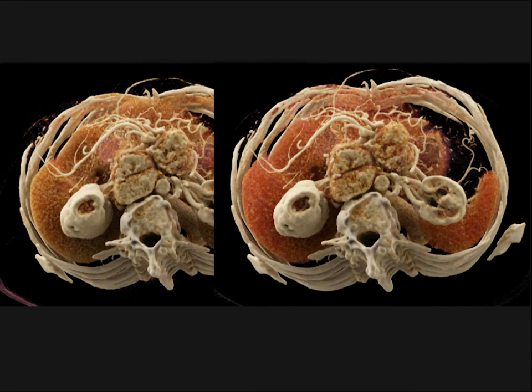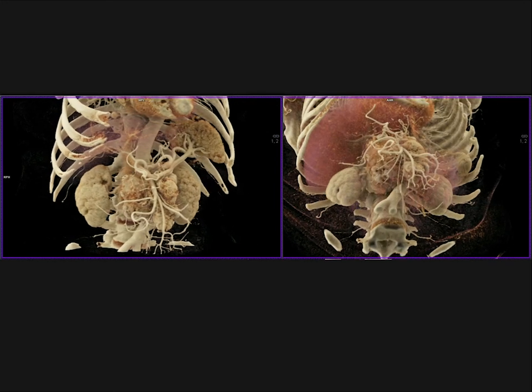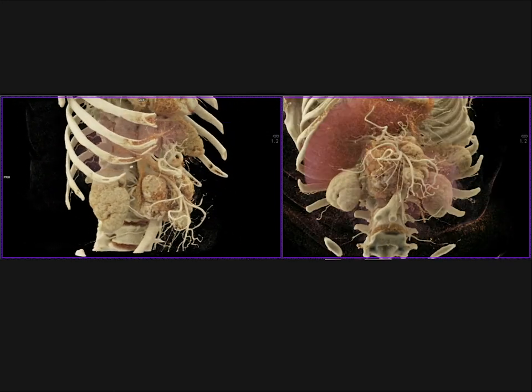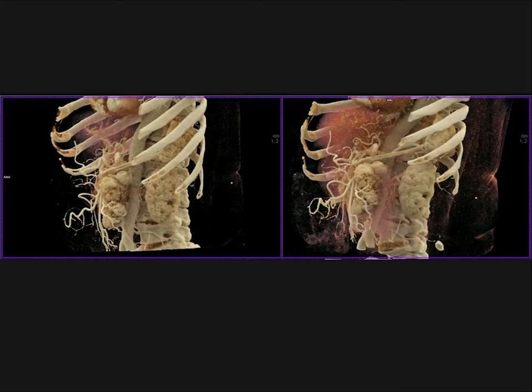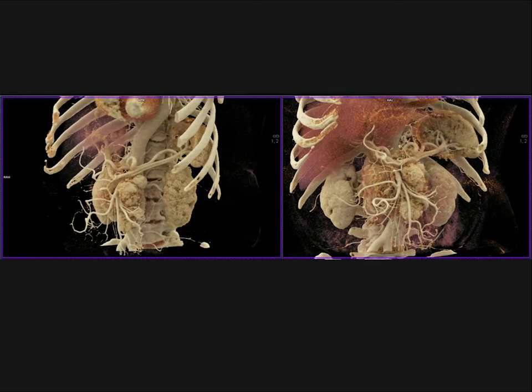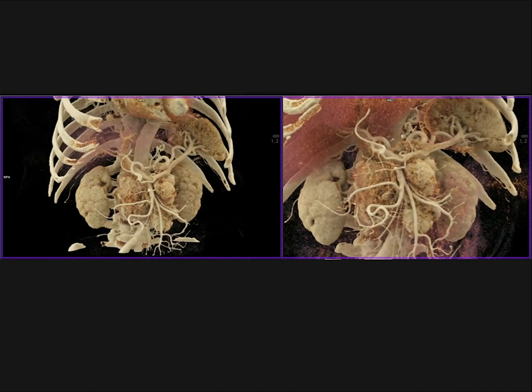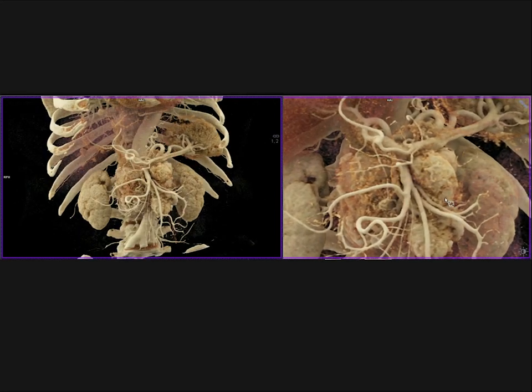And here's just a few more cinematic views from below and from above. And here's one where actually you can see the motion. So I just wanted to give you a feel on this image that the motion at times can be very helpful, showing you the integration and the appearance of the vessels and the relationship to the patient's tumor. And I think it's nice and helpful in this situation.